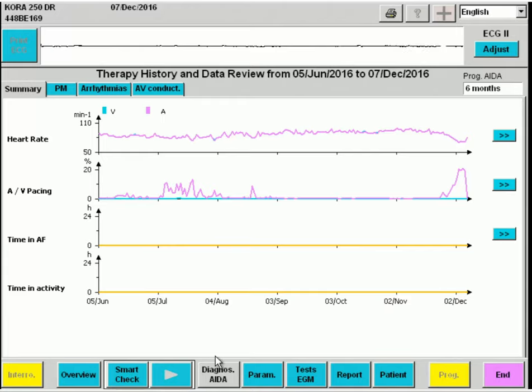The Diagnostics AIDA button permits us to interrogate the pacemaker memory. AIDA stands for Automatic Interpretation for Diagnosis Assistance.